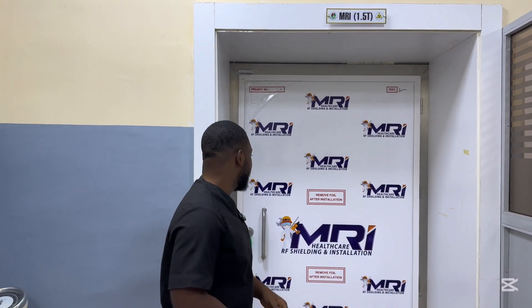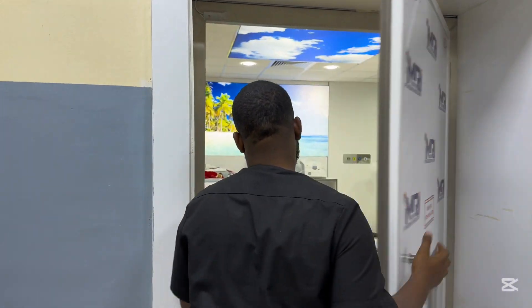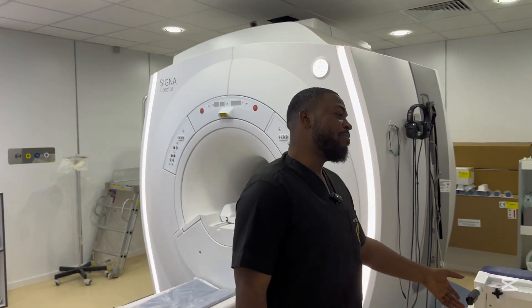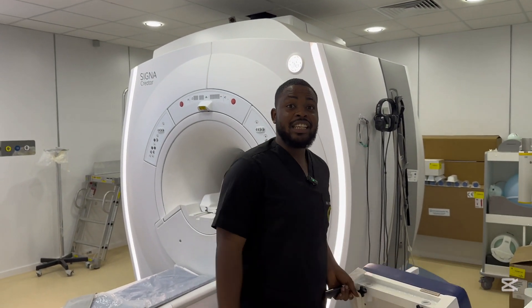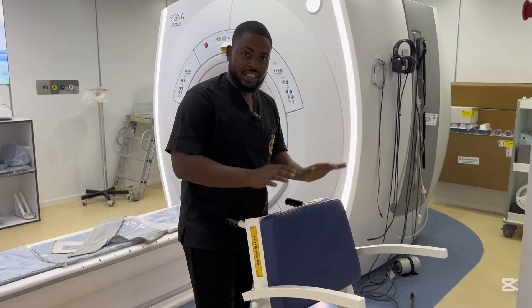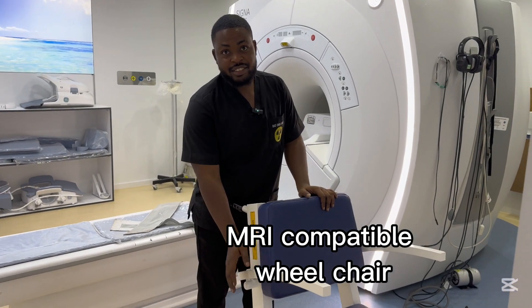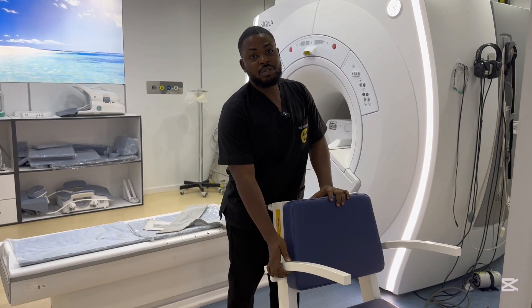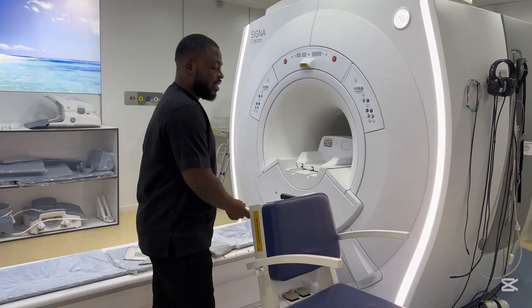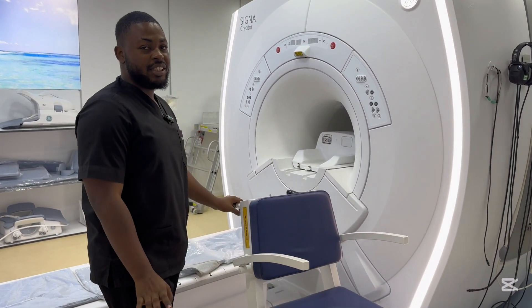Let me show you what the GE 1.5 Tesla MRI looks like and all the accessories attached to it. Firstly, because it's a very big MRI machine and uses helium, the magnetism is very very high. It comes with this wheelchair — they made it using very low ferrous metal so it doesn't get sucked into the machine, no matter how close you bring it.